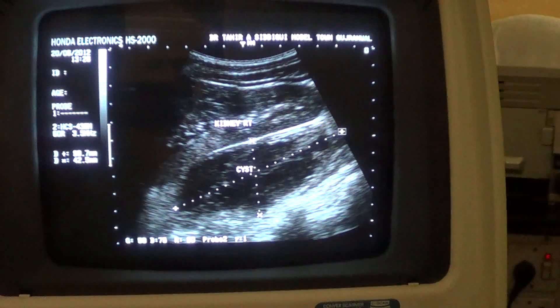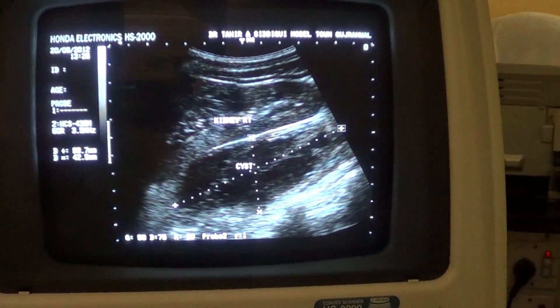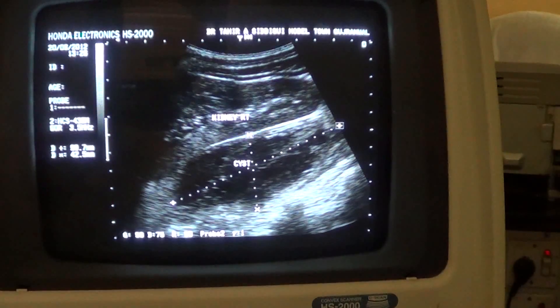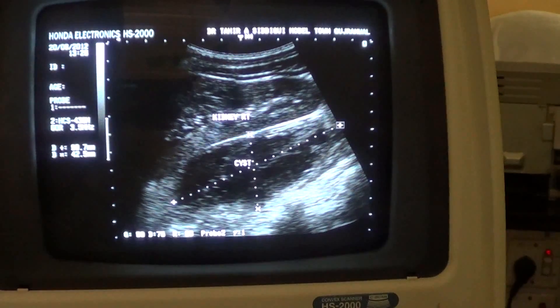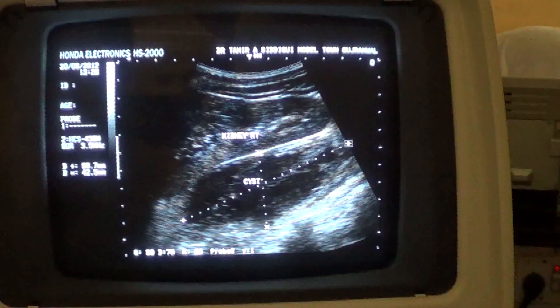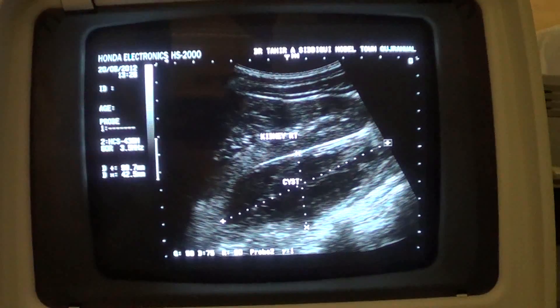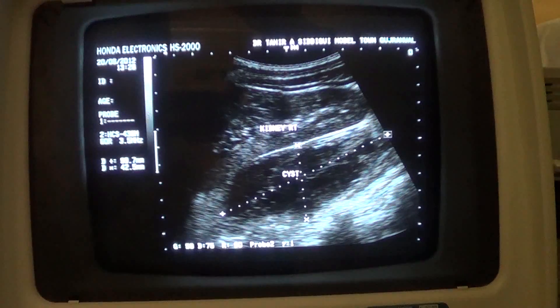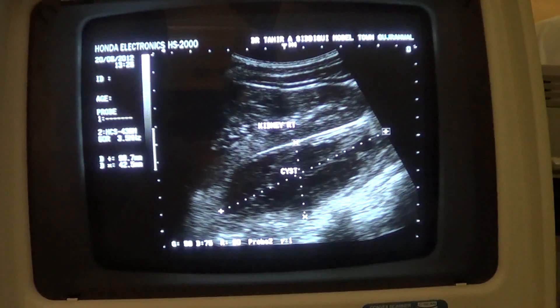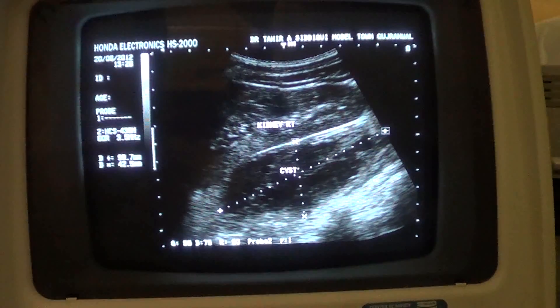This cystic area is posterior to the right kidney. The kidney glides over it. This ultrasound finding is consistent with a psoas abscess — this is the right psoas abscess. The patient was referred to me to rule out PUO of three months' duration.